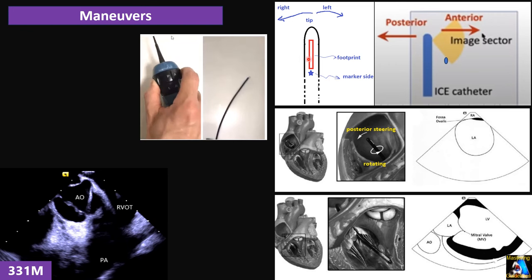Image C demonstrates our imaging protocol for the ascending aorta in patients in whom left ventricular access is to be obtained via a retrograde approach. From the RVOT, with clockwise motion after imaging the aortic valve, open the ascending aorta. In this case, a complex aortic plaque with a mobile component, presumably a thrombus, is seen during the initial screening and is pointed by the red arrow. The retrograde approach is abandoned and a transseptal approach was chosen instead.